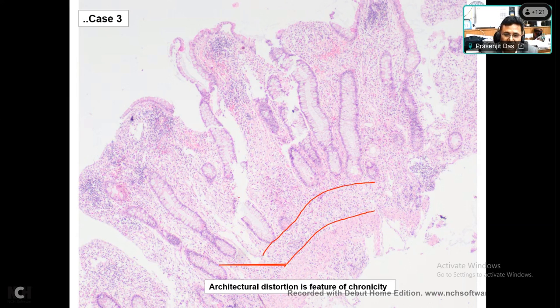Okay. And you have already talked about the eosinophils. In the ileocecal junction, eosinophils are normally more, okay? Because there is a stasis, physiological stasis, of the contents, okay? The food antigens, the infection goes on there. So that's why eosinophils are always more in that place. There are two sites in the intestine where eosinophils are more. One is the distal 2 centimeters of the esophagus in children, and one is the ileocecal junction.